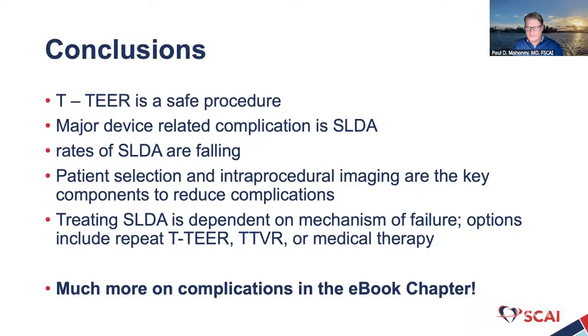That was fantastic. We definitely see some themes emerging here in all the different speakers: being very meticulous in your alignment and your pre-grasp sequence is going to be critical for preventing complications. Preventing complications is always the best way to keep out of them. I think you showed some very nice approaches to managing SLDA, and you're right, the worst thing you can do in the tricuspid is to immediately rush in with another clip and have a second SLDA. You really need to stop and think about what you want to do next, and maybe even take the patient off the table and come back a different day.